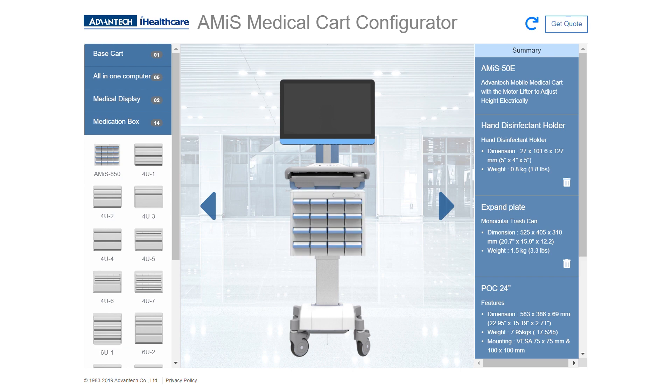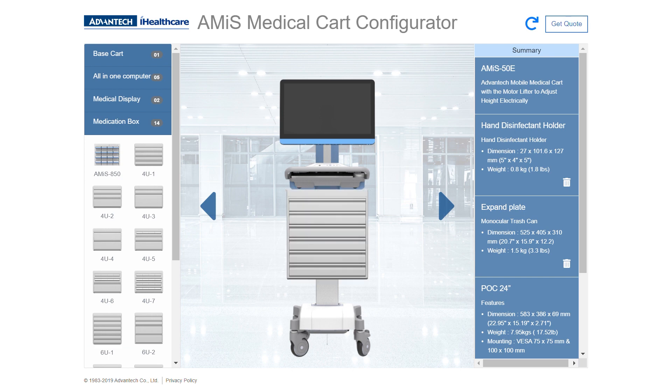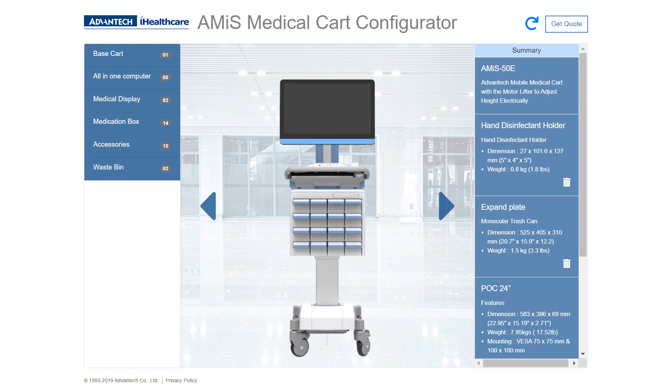Next, let's add a medication box. You'll see that we have a wide variety already loaded in the system for you to choose from. I like the AMiS-850.